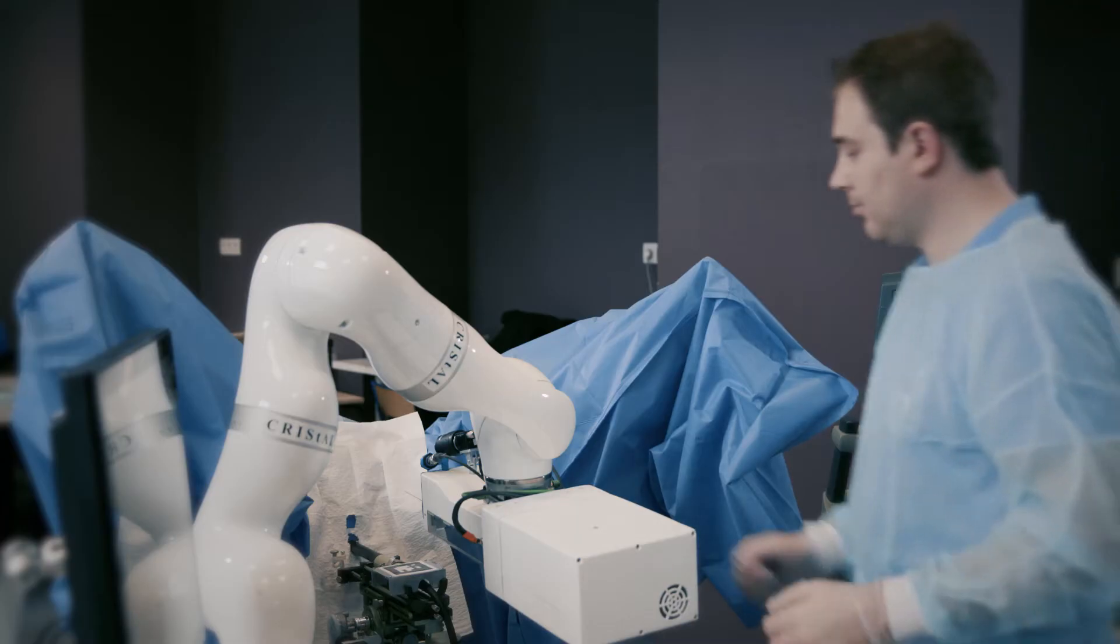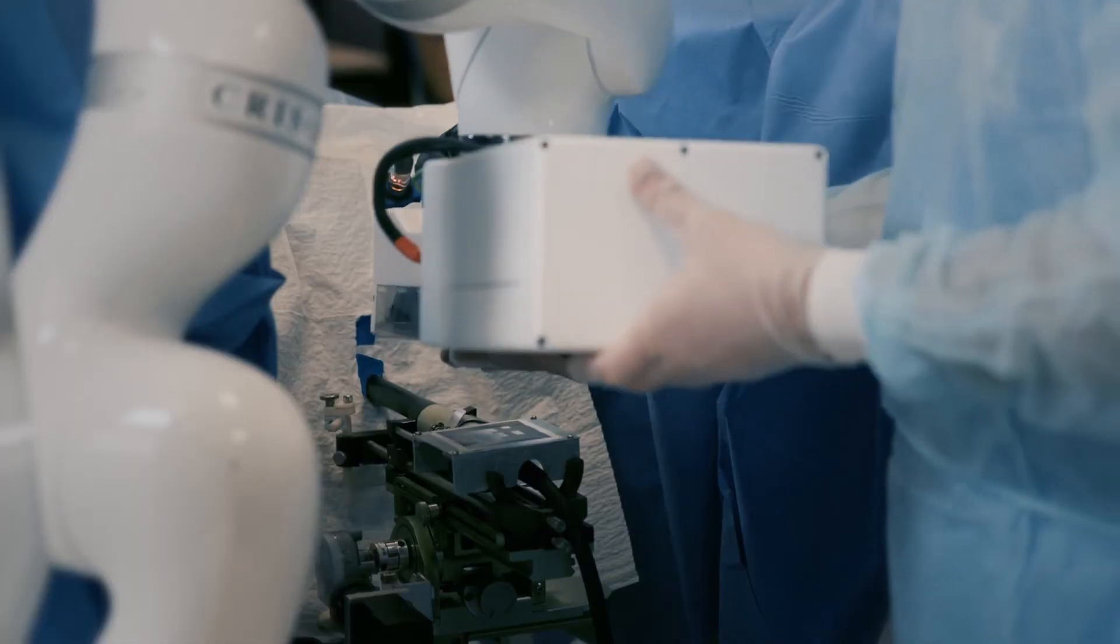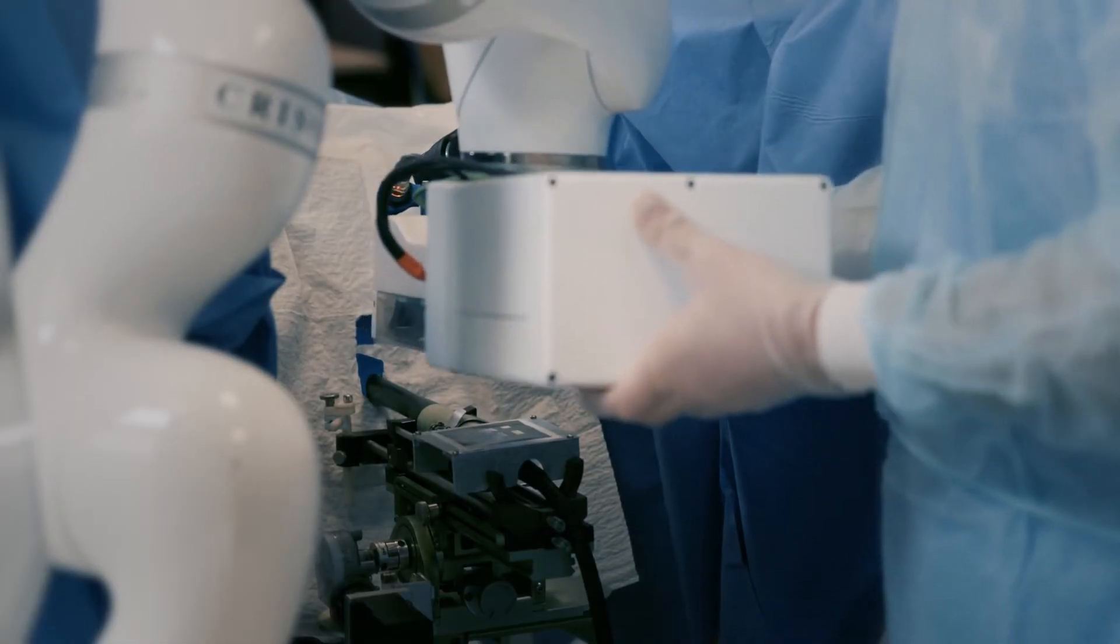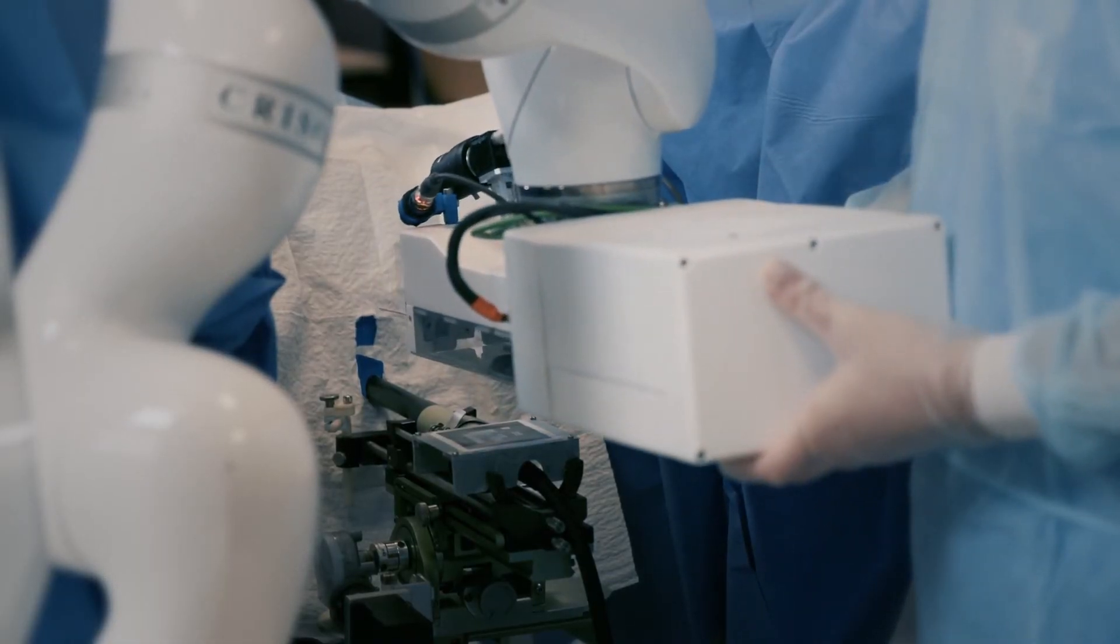A redundant manipulator robot is used to handle and guide the needle holder. The initial positioning of the needle can be manually managed.